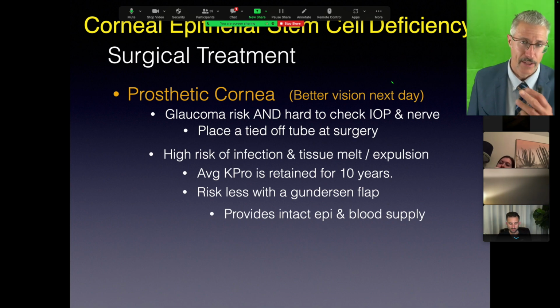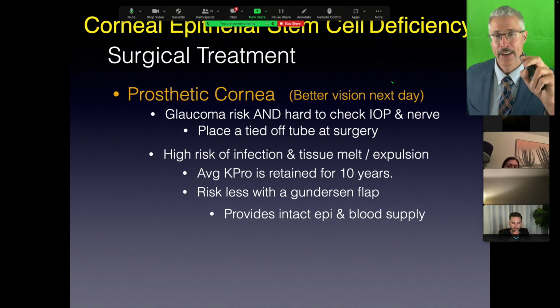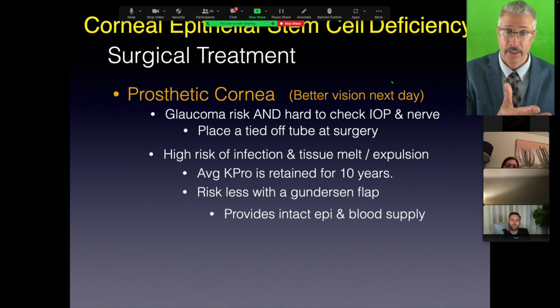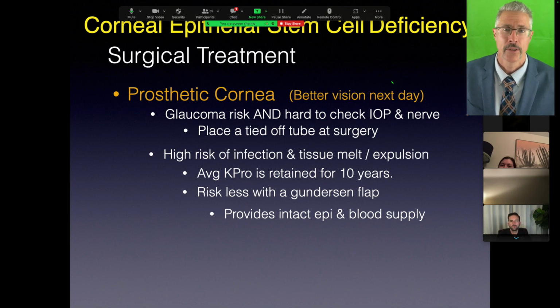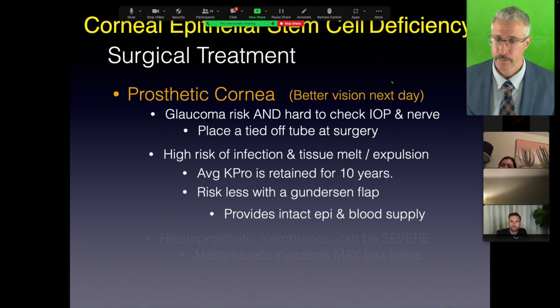Now we found out, as I alluded in those other videos on YouTube, if you put a conjunctiva flap over the top, let it sit, let it scar, let it heal, it actually will help vascularize the cornea just beyond the plastic optic in the middle. So kind of like for those infected cases, we're providing an epi-barrier to infection, as well as bringing the immune system, boom, right to the site so that it vascularizes. Go ahead, reject this cornea. I want you to. I want the immune system here ready to defend the area so it doesn't break down. We've actually had a few cases where that's done really well.